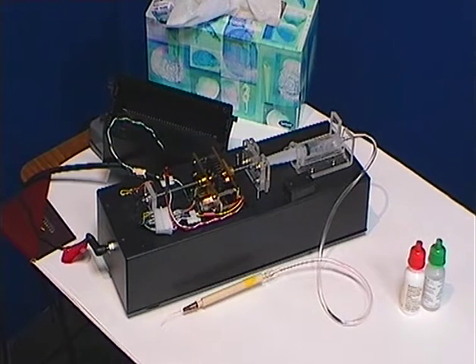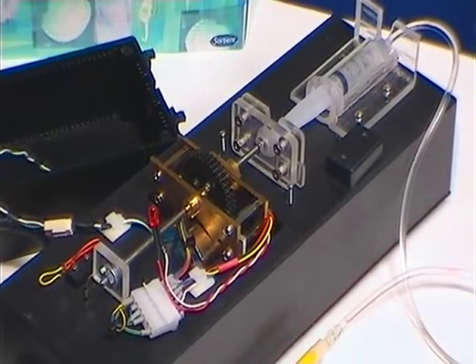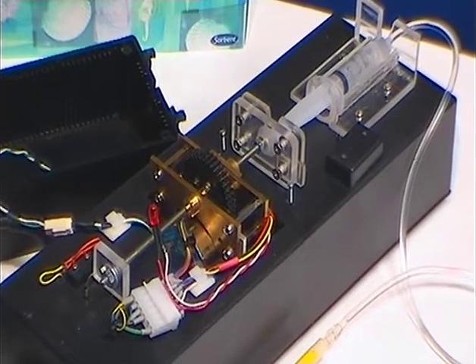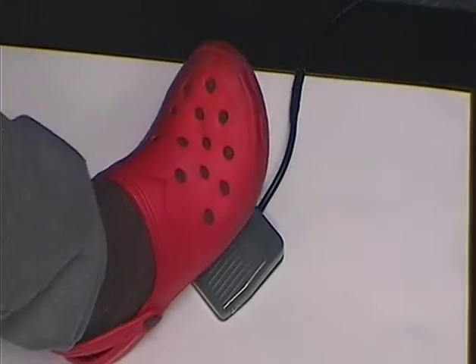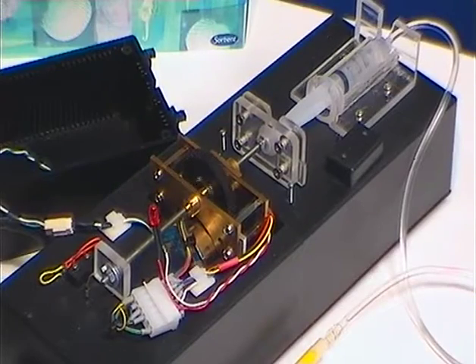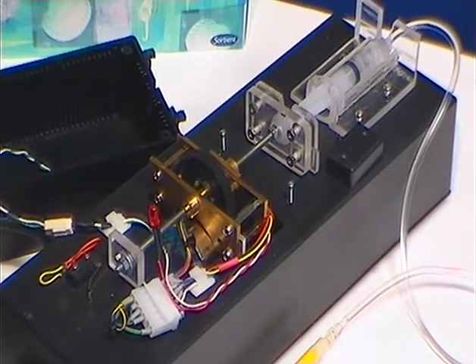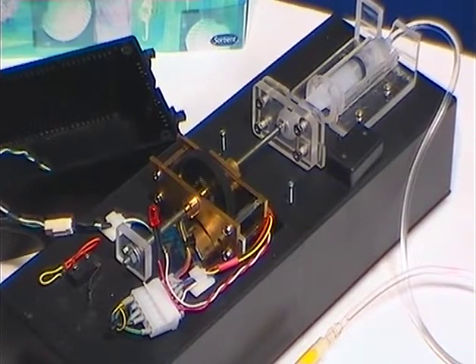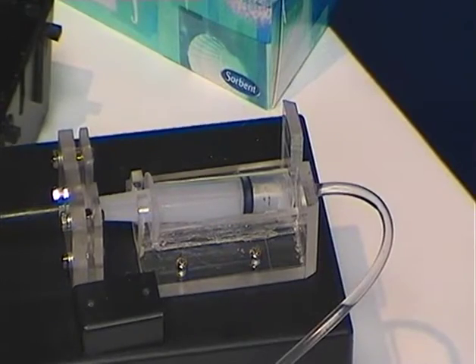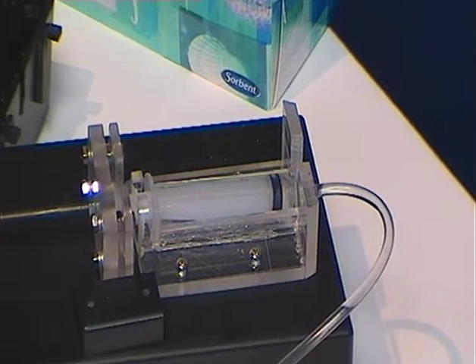There are many automatic infusion devices on the market for IV or gastric and so on. These are expensive and simply don't deliver sufficient volume or pressure which is appropriate to the lacrimal apparatus. In our clinic, we've developed an automated infusion device which addresses the problem of cannula instability. A foot switch activates a worm drive mechanism, and this pushes in the plunger on a 5 ml syringe, delivering saline in appropriate volume and pressure.